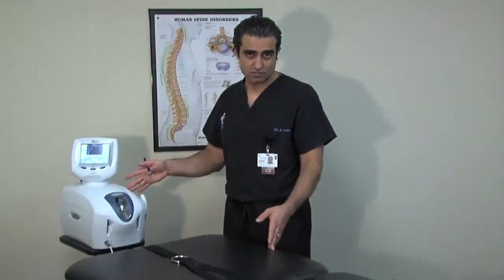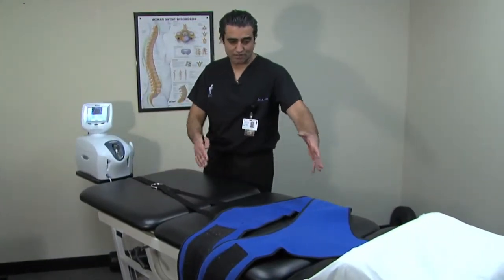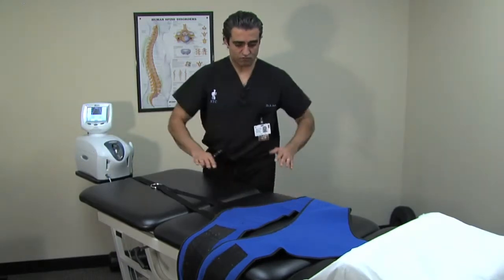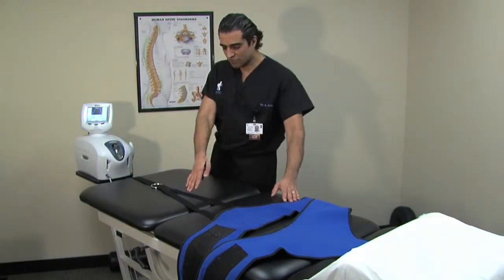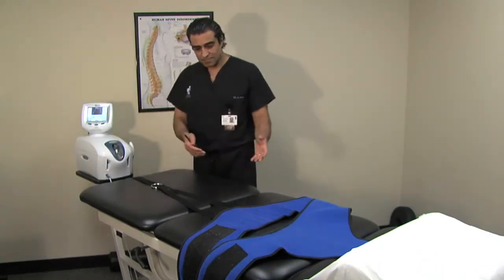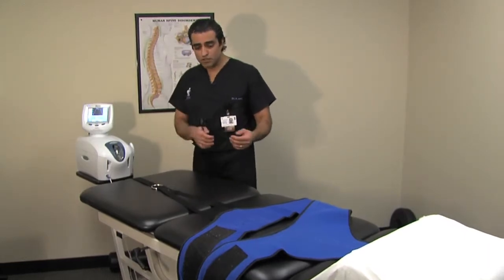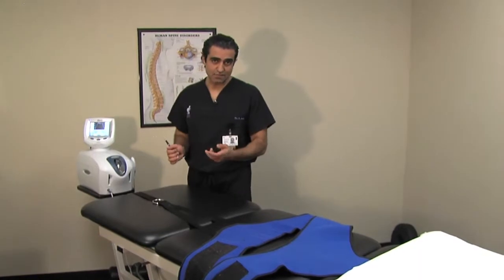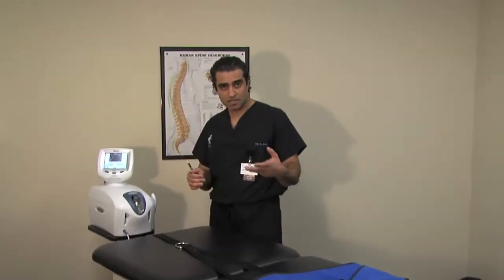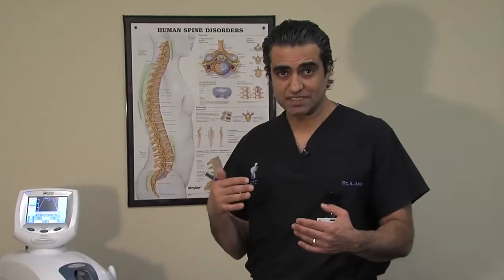Now, this is the table that we use for our traction decompressive treatments. As you can see right here, the patient comes in, there are two straps. One is for the chest and the other one for the hips. And the strap for the hips is connected to a computerized traction device that keeps a constant tension on a computerized program. After all, you cannot just stretch the ligaments. You have to stretch, let it go, stretch, let it go, and that way you can get the best results in terms of relaxation of the ligaments.